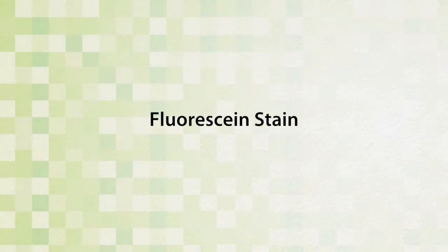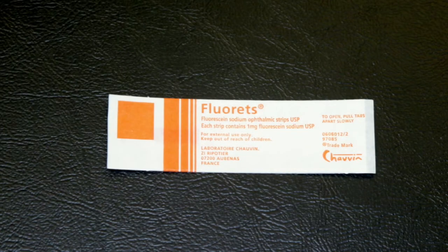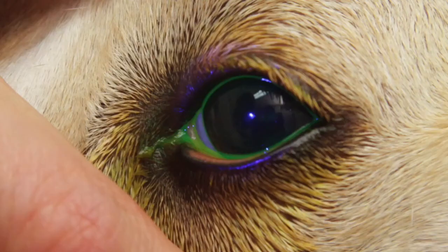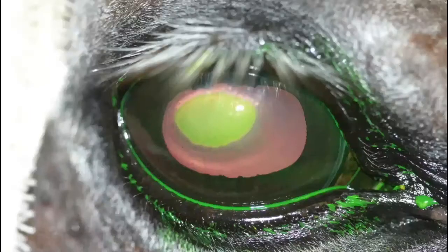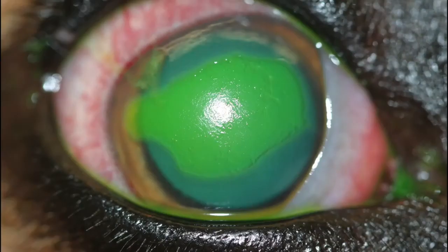Fluorescein staining. Fluorescein dye is a water-soluble dye which can be used to detect corneal or conjunctival ulcers and to assess the patency of the nasolacrimal system. Due to its lipid insolubility, fluorescein does not penetrate the intact corneal epithelium. When epithelial erosions or ulcers are present, the hydrophilic corneal stroma is exposed, which allows penetration and retention of the dye. This is visible as a bright green stain on the cornea.